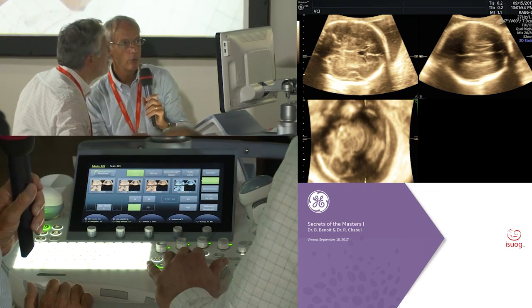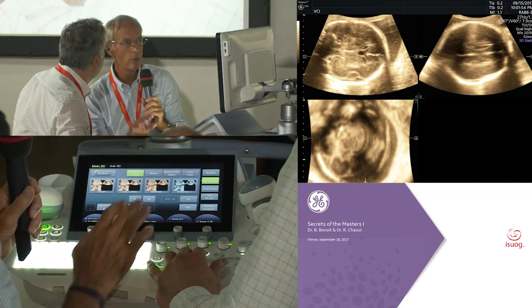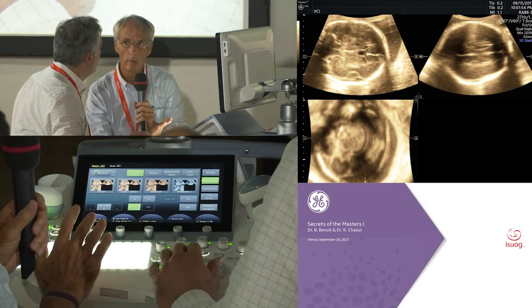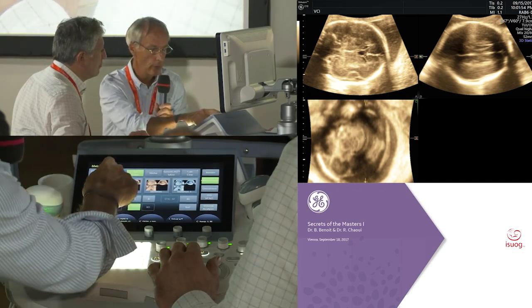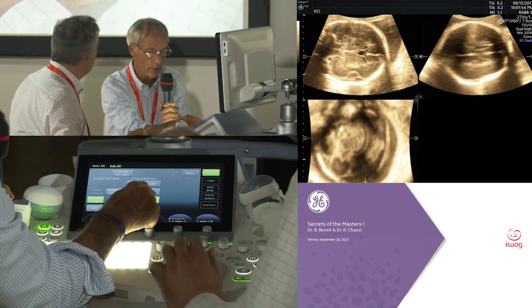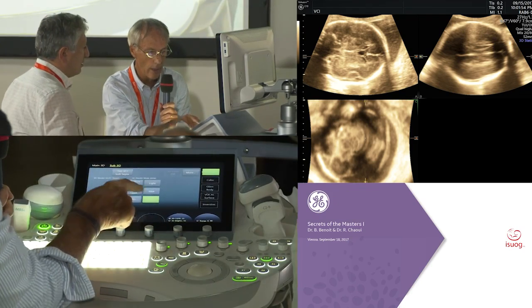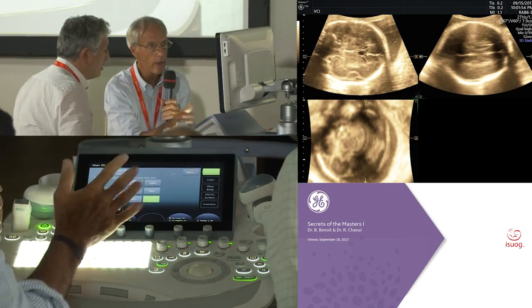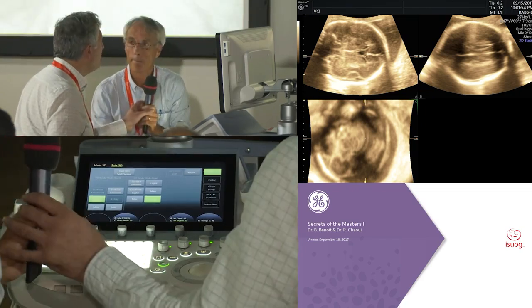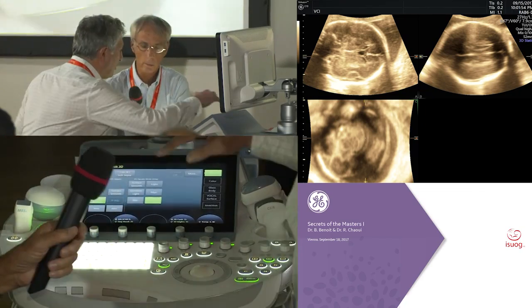2? I use for the brain and the soft tissue always between 2 and 4 millimeter, and with the X-ray mode, because it is transparency mode, and we can see here on sub 3D, and it's X-ray, it was 80%, now I put it to 100%. Okay, I'll show you a trick. Not many people know very much about this button.